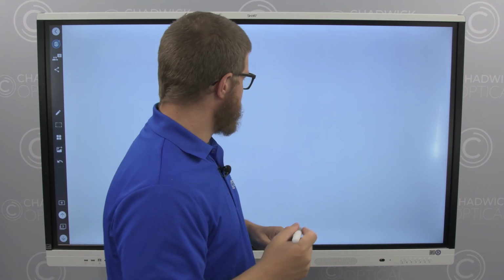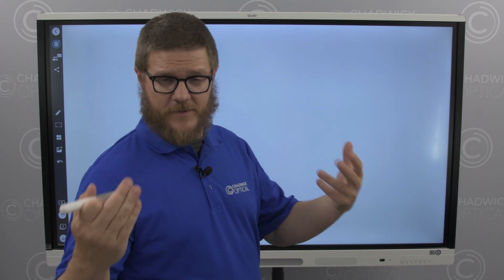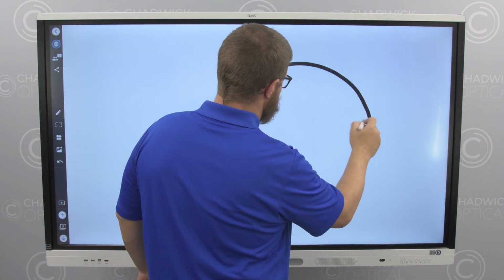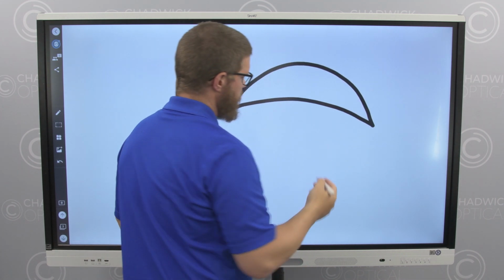Now, aspheric is a very interesting thing, but there are some things that we want to be cognizant of when we're selecting a design. When we make the lens, we want the back surface to be concave in some way.